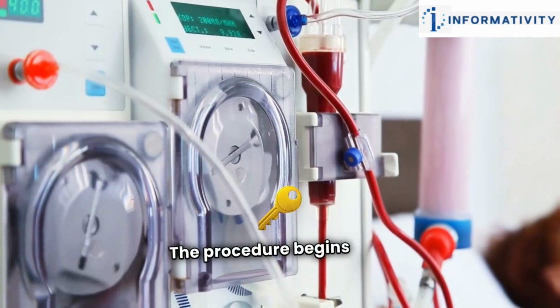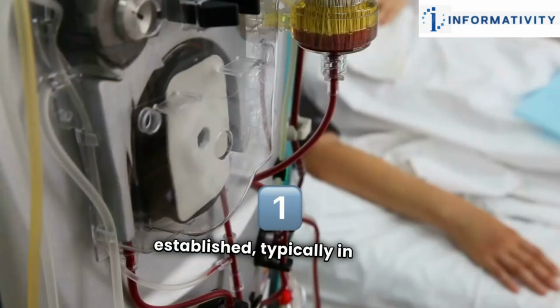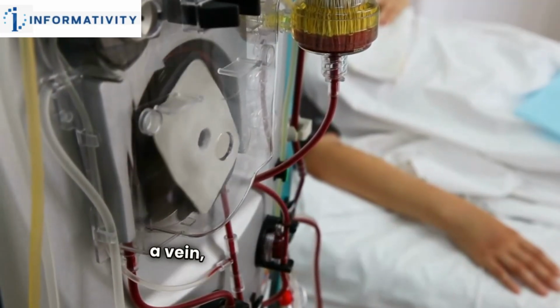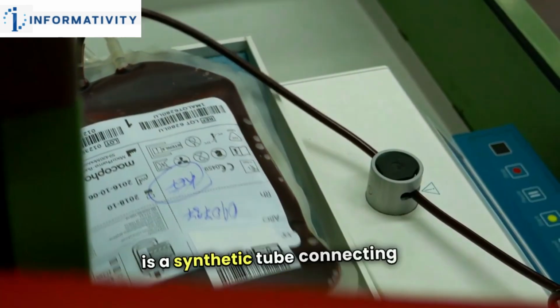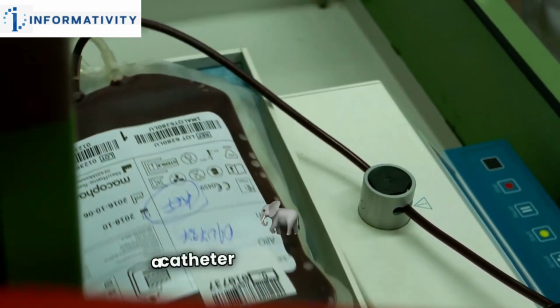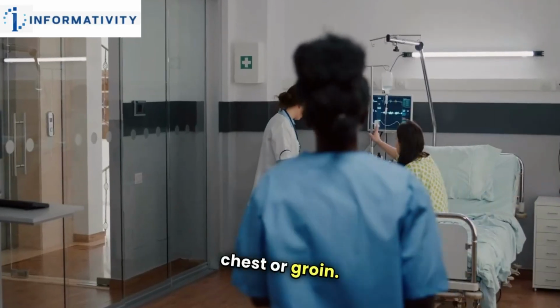Hemodialysis is the most common type of dialysis done in hospitals. The procedure begins with preparation, where a vascular access is established, typically in one of the following ways: an arteriovenous fistula, which is a connection made between an artery and a vein, usually in the arm; an AV graft, which is a synthetic tube connecting an artery and a vein; or a central venous catheter, which provides temporary access via a catheter inserted into a large vein in the neck, chest, or groin.